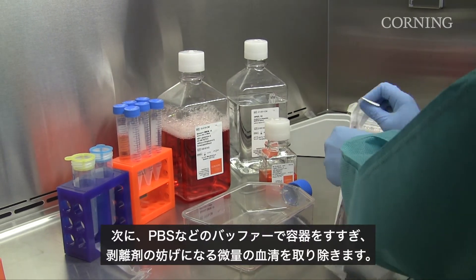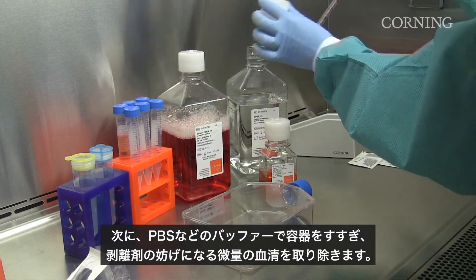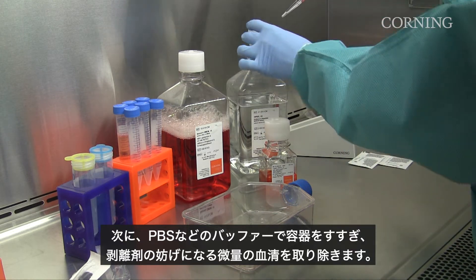Next, we will rinse the vessel with a buffer solution, such as PBS, to remove any trace amounts of serum that could interfere with the dissociation reagents.